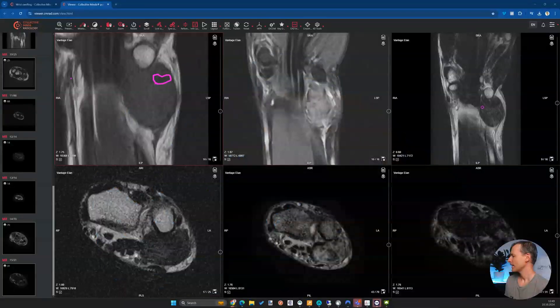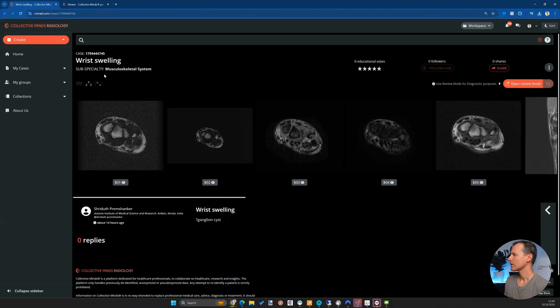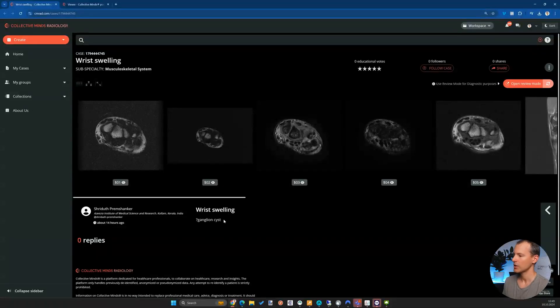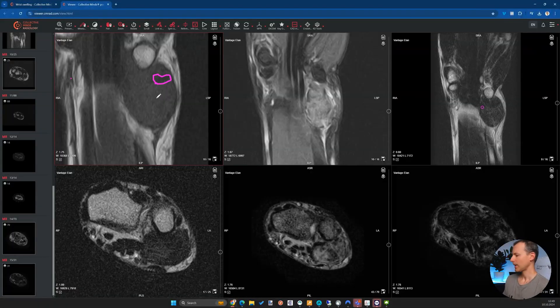The case was posted on Collective Minds. Let me share my screen so we can see the MRI. It was posted with the query of wrist swelling — that was the clinical presentation — and the question by the clinician was whether this was a ganglion cyst or not.